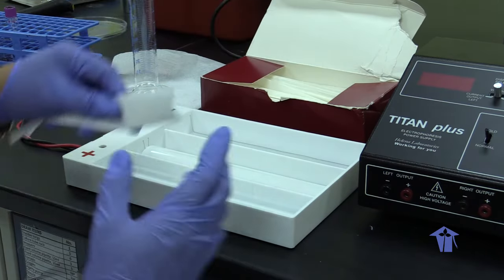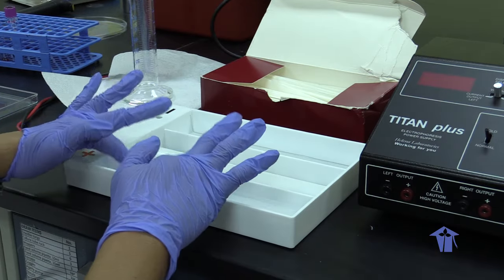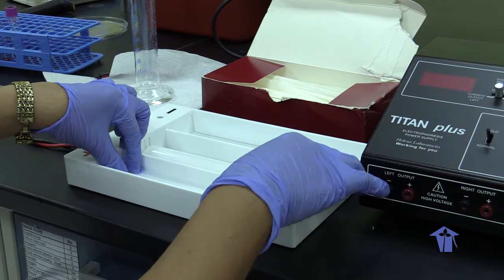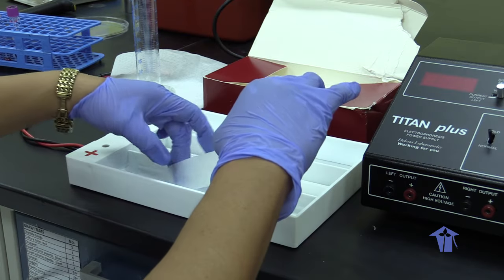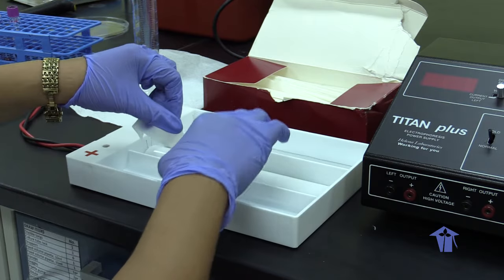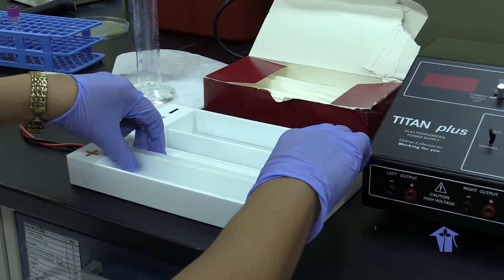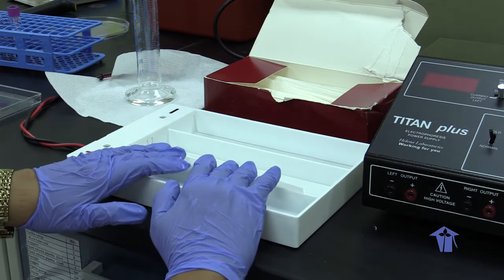I'll show you how the actual wicks are placed on one side, so we just have to repeat it to the other side. So we place the wick into the buffer. Ensure that the bottom is in solution, and we fold.